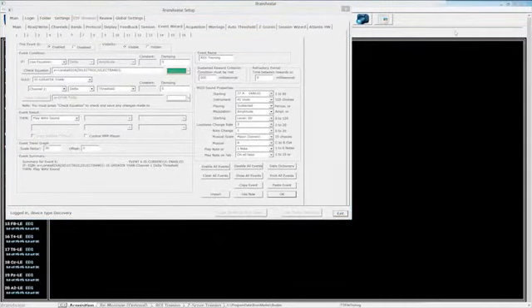Now, it is 4:46. If you guys wanted to, I had one very advanced protocol that I was going to break down: why you do the things, what's going on with it, and all the different features and functions that go into it. It elaborates on a lot of the different things I was going into. But as I said, we're going to be running out of time right here. So if you guys would like me to continue, I'll continue.